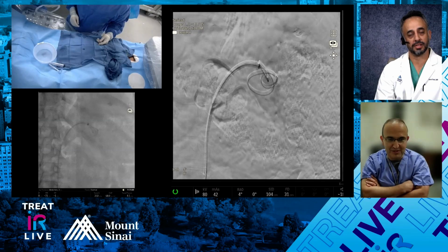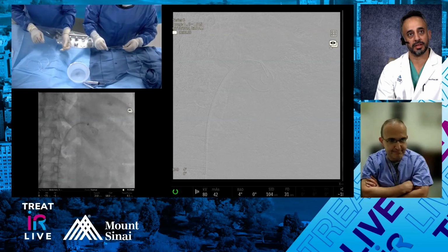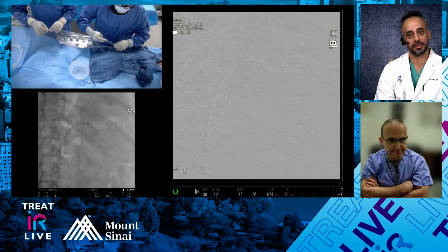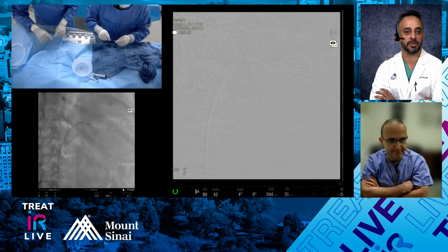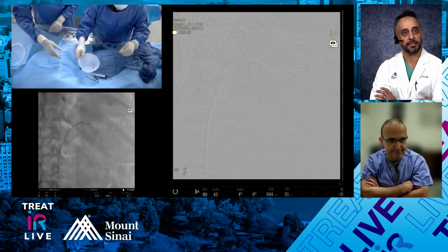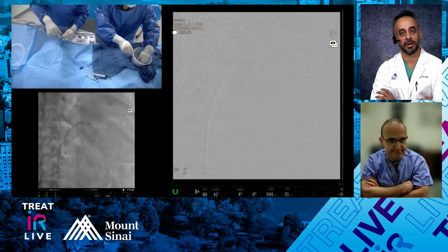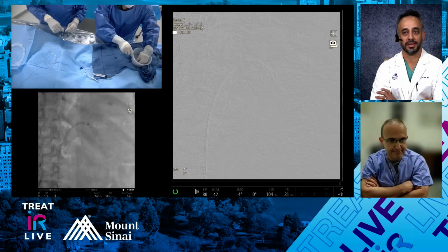Sure. Now, thoughts from both of you on that kind of size? Are we talking fibered or non-fibered? Is there a difference? How does it feel with either of them? It depends on what you prescribe to. In terms of data for aneurysms, most of it's from neuro, and in terms of durability, they're unfibered coils and looking at packing density, that 24 to 27% packing density. On the peripheral side, we don't really do that. It's a little bit different because we can also coil the inflow, which in neuro you obviously can't do.